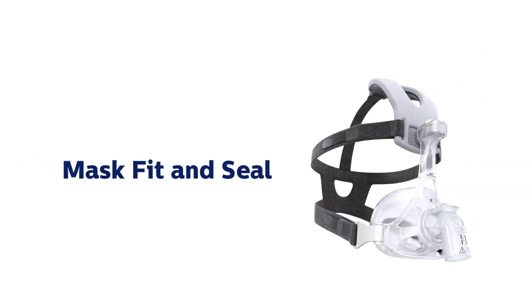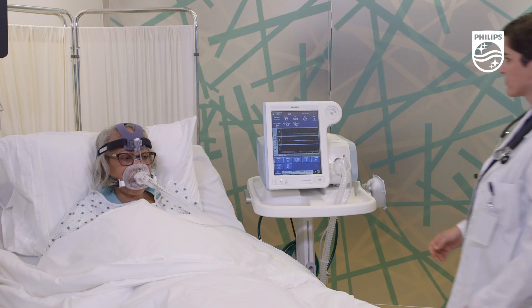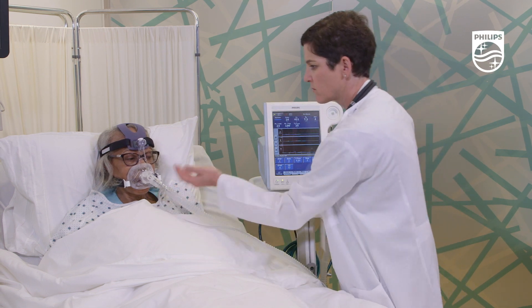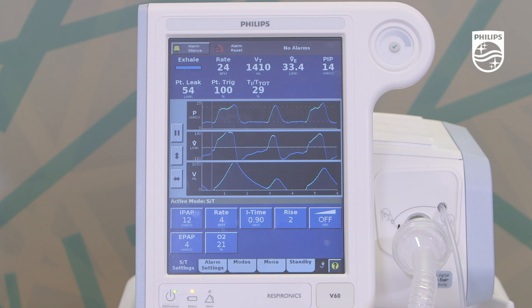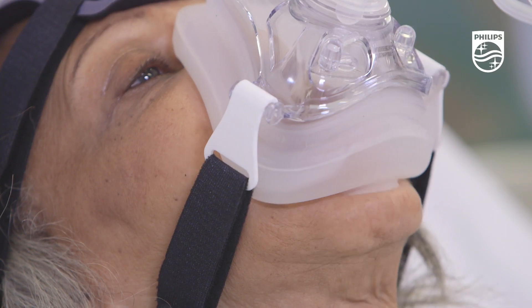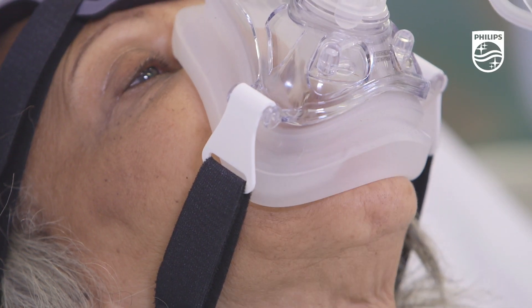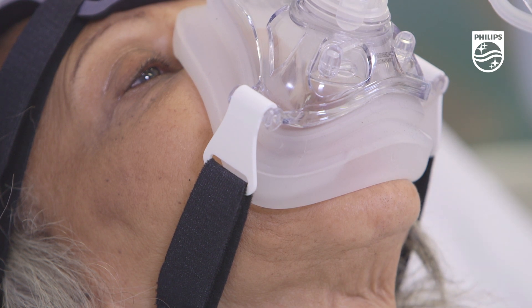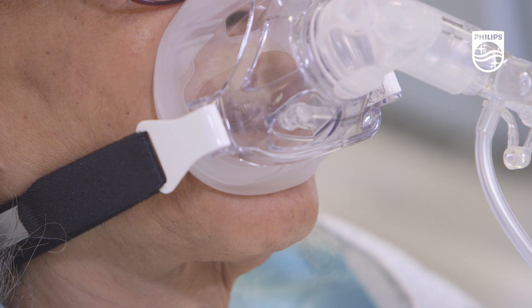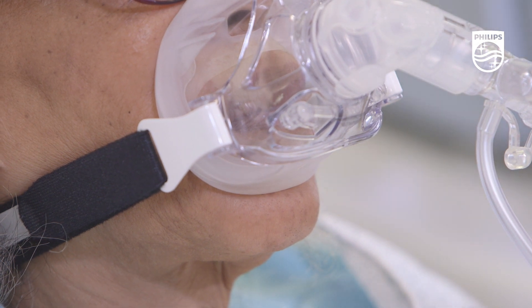Once the mask is on and connected to the circuit, ongoing adjustments may be necessary to manage the leak due to changes in patient position or settings on the ventilator. Keep in mind, the mask fit doesn't need to be airtight to deliver effective NIV. In fact, over-tightening may actually create a larger leak by defeating the self-sealing design of the cushion.